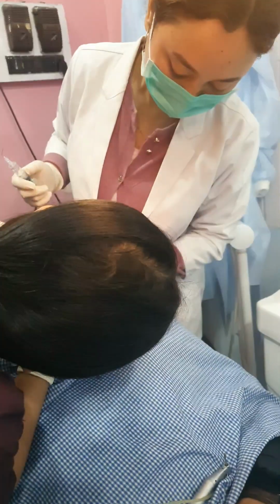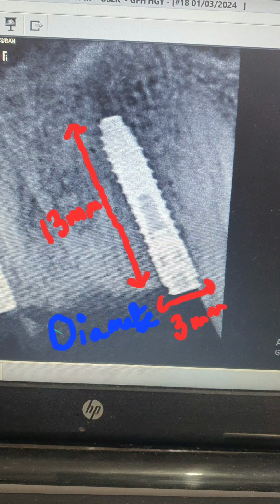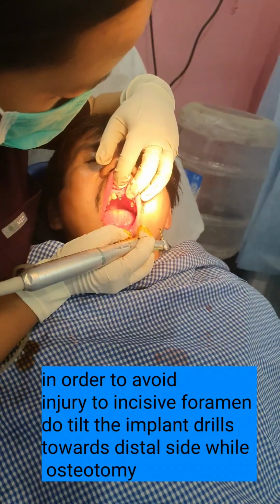Therefore, torque and osseointegration are very important factors for the success of the implant. This is a 3 mm diameter implant with 13 mm length. The distance between an implant and a natural tooth, that is the canine on the adjacent side, should be at least 1.5 mm. Now starting with the central incisor dental implant placement.